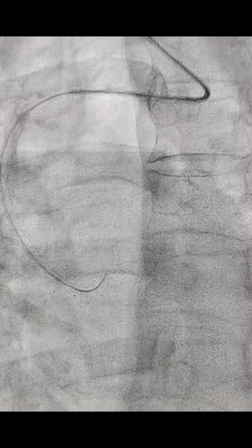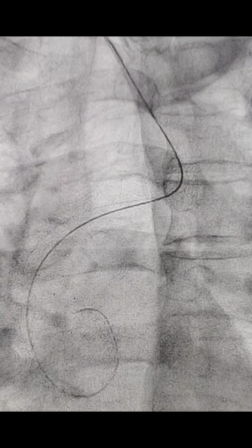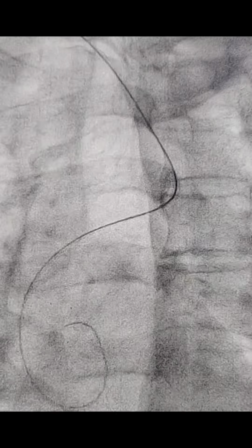So this is a 50 year old male patient, diabetic, hypertensive, presented with inferior wall ST elevation MI within 2 hours of chest pain, and we decided to do the primary angioplasty. This was a radial approach, but you can see there is a lusoria, and we could not engage the artery here. That is why we changed the approach to the femoral.